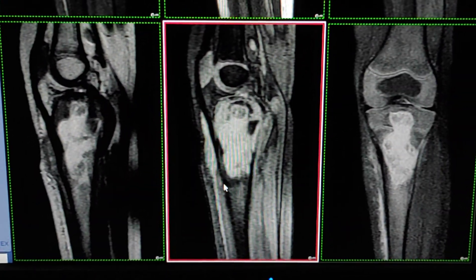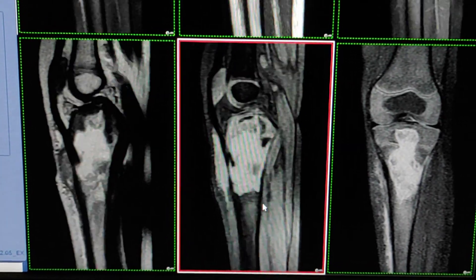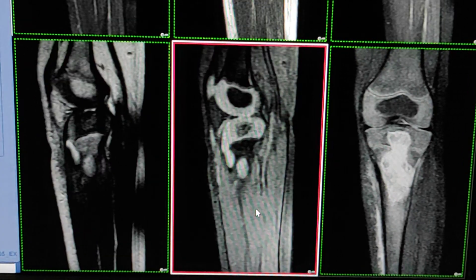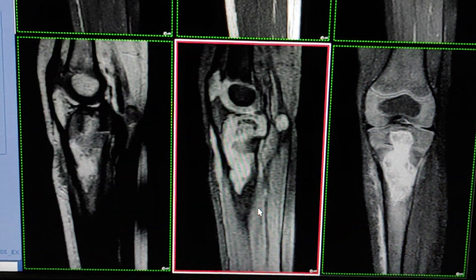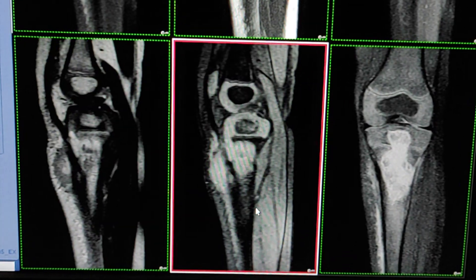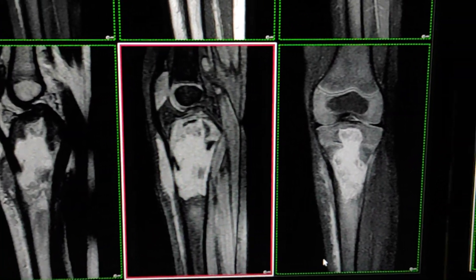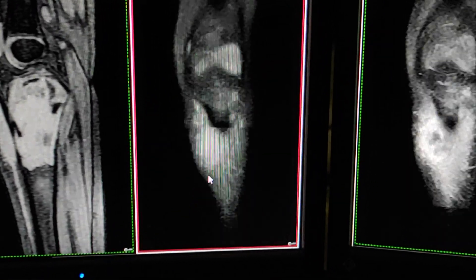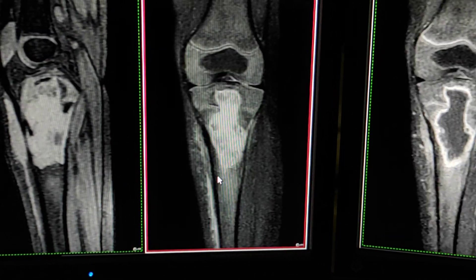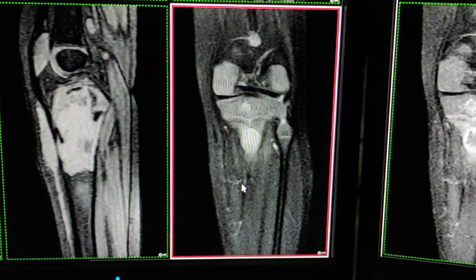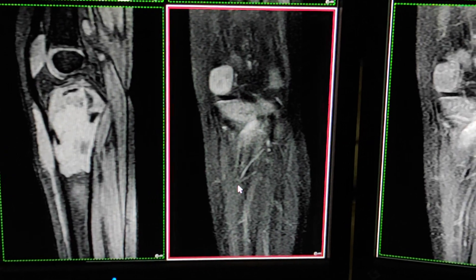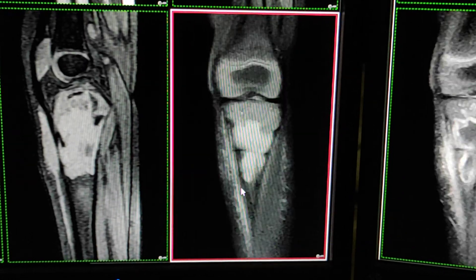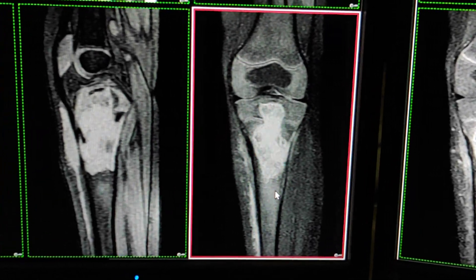The fourth sequence is GRE gradient, going medial to lateral. Now this is coronal fat-sat PD. The scan was done under sedation because the age of the patient is only 1.5 years. This is the fat-sat PD sequence.